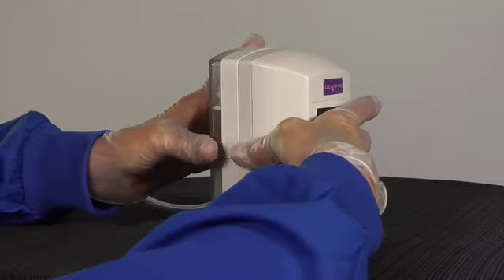To remove the canister, simply push in on the canister arms and gently remove the canister from the pump. Dispose of the canister according to your facility's protocol.